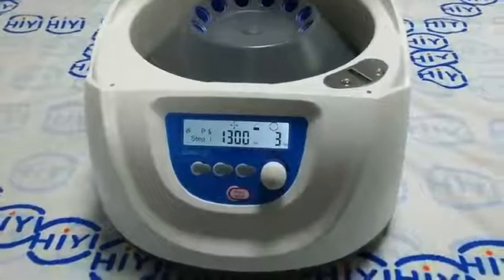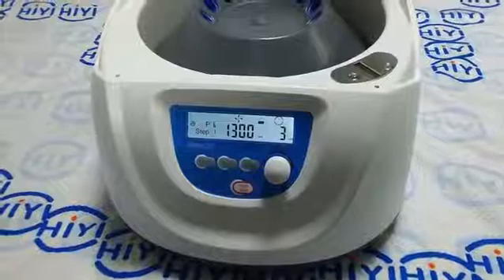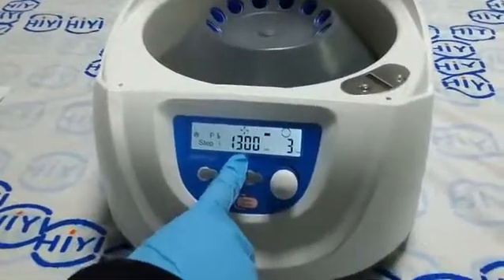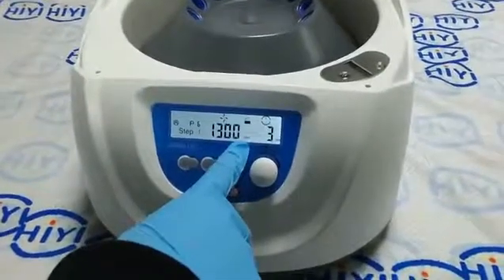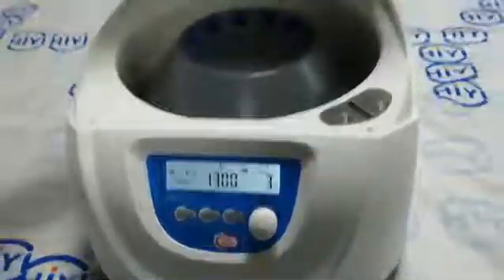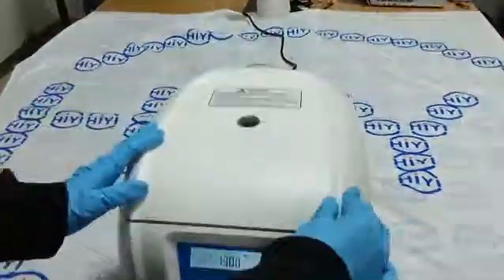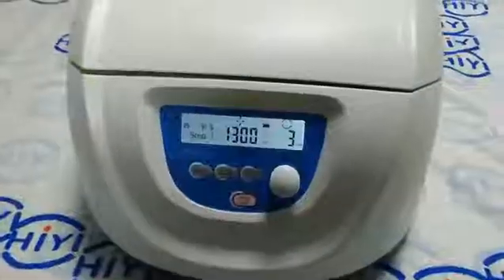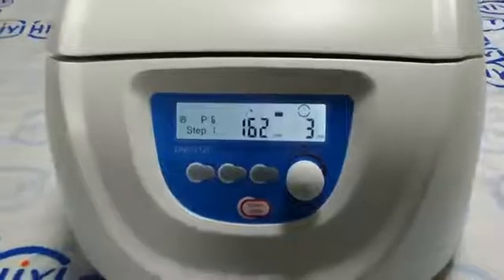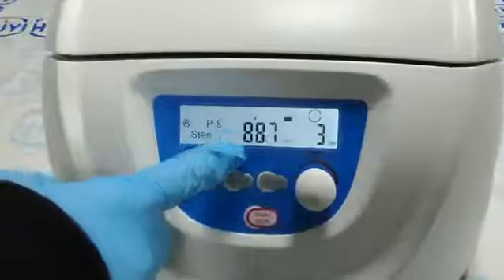Then we show the centrifuge how to work using program 6 that we just set. The speed is 1300 rpm and the time is 3 minutes. Then we close the door and press the start button. The centrifuge is now operating.